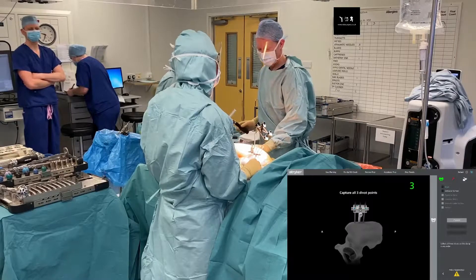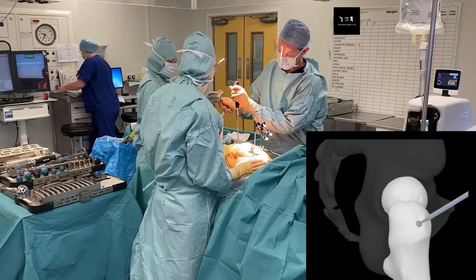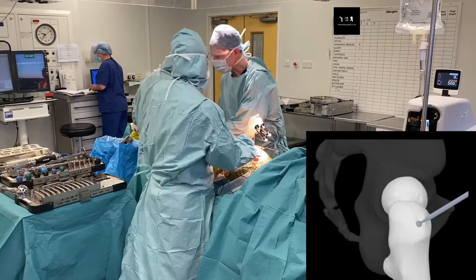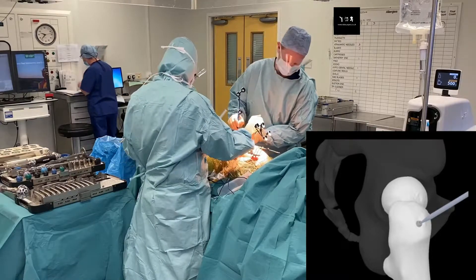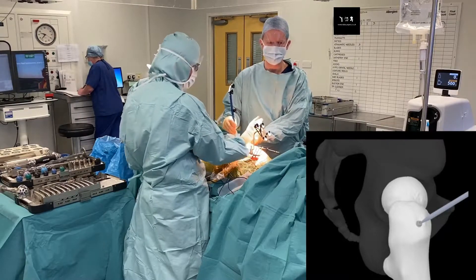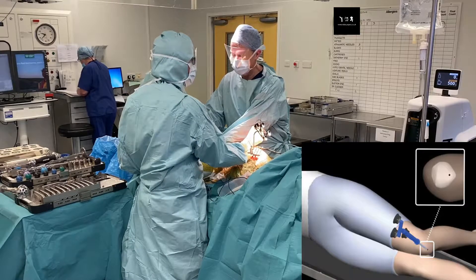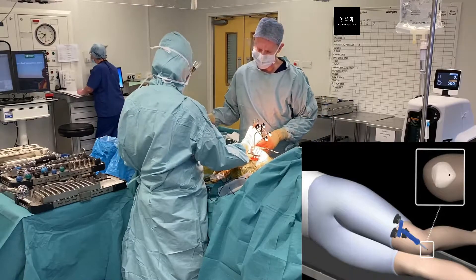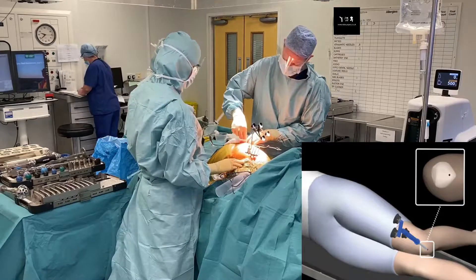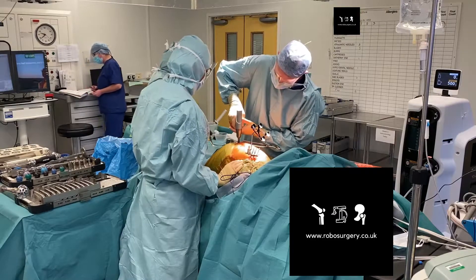Here we've put our tracker and fixed it firmly onto the pelvic pins, and we're able to aim that towards the sensor at the head of the table. I've now placed a pin in the greater trochanter, which is called a reference pin, and here I'm marking the reference pin before we dislocate the hip. We mark the reference pin at the tip of the trochanter, at the lateral aspect of the trochanter, and also mark an ECG dot that was stuck on the lateral aspect of the distal femur as two reference points. Now we are going to dislocate the hip, and these reference points can identify the offset and the leg length at a later date in the operation.